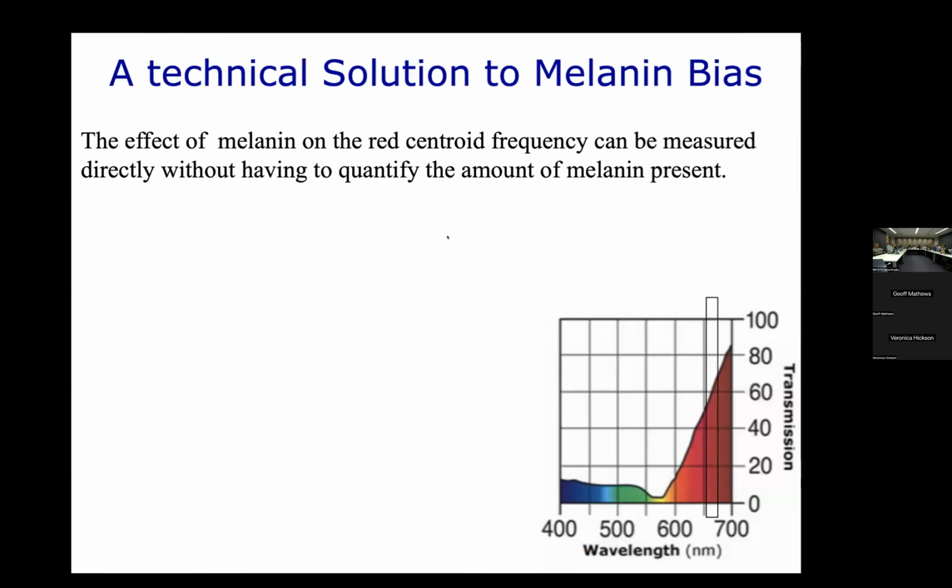Melanin. We're of the opinion that whilst melanin is the cause, it's the effect we should be looking at. We should be looking at the impact of melanin on transmitted red wavelengths.